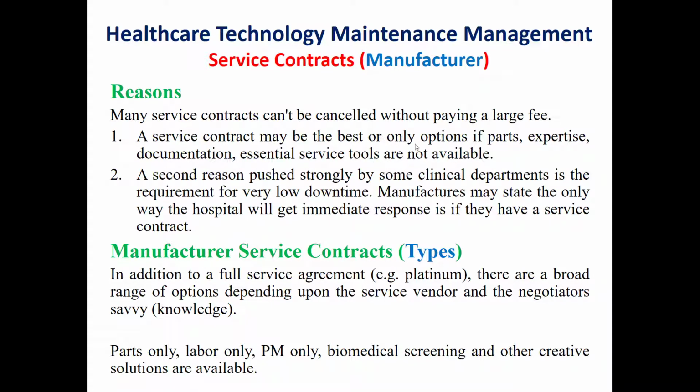A second reason, pushed strongly by some clinical departments, is the requirement for very little downtime. This is another reason for having such type of service contracts.